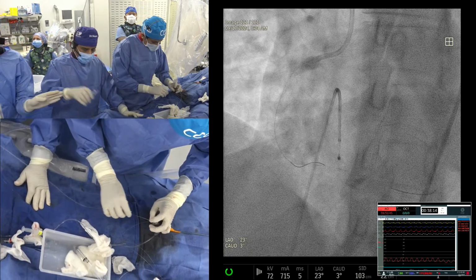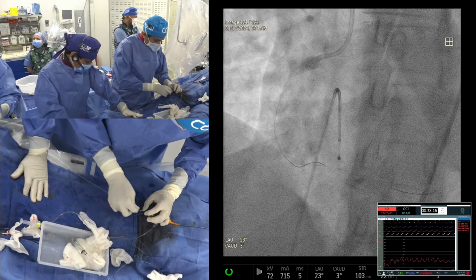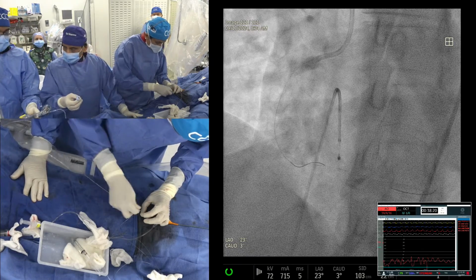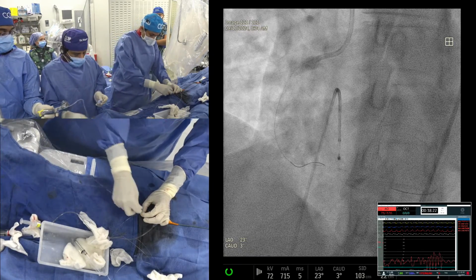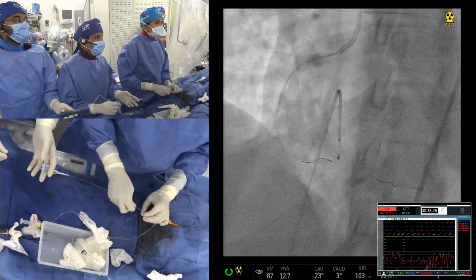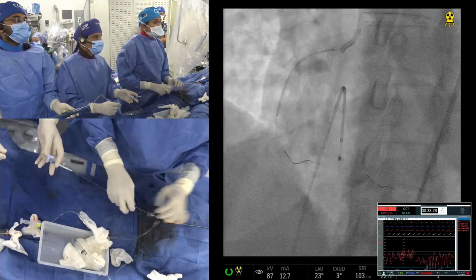So how do you say it? Massive nodule, or more than 0.5 millimeter thickness, and the nodule, heavy calcium. Those should be the massive class C, not B. I mean, all sorts of thoughts on this.